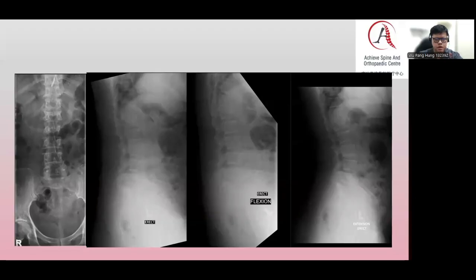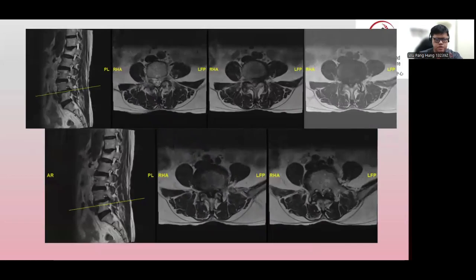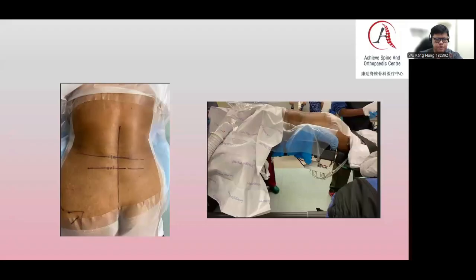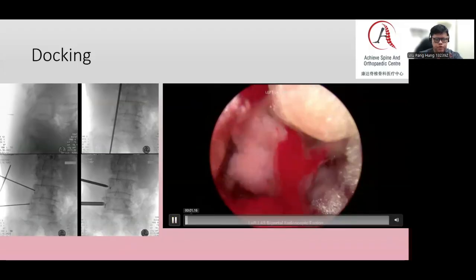I started doing endoscopic fusion in 2020, and this is one of the cases done about a year after I started practicing. But it is nevertheless one of the classical cases, L45 spondylolisthesis with severe spinal stenosis. We position the patient prone on a ProAxis table. We mark the levels. For the left L45 approach, we mark where we want to put our pedicle screws through at the left L45. And this is a video showing how it's performed.